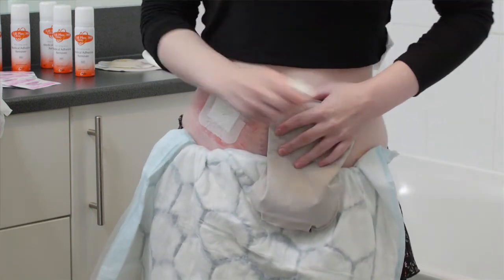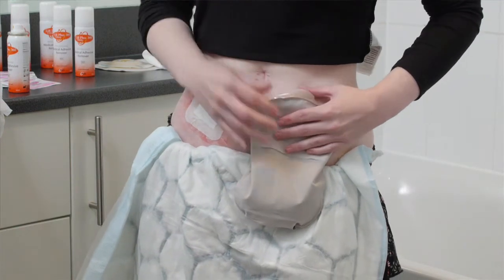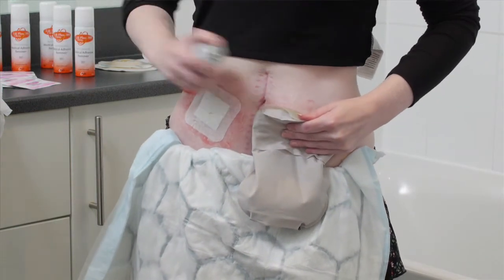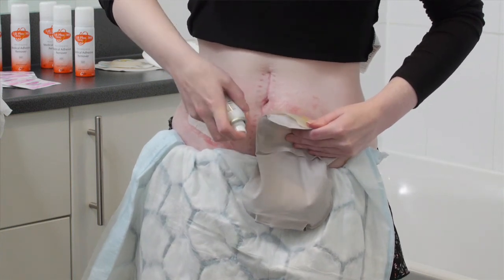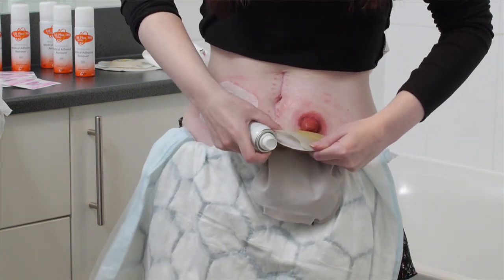The fact that you can spray the can at all angles and it gives an even flow is really good, so that you can just remove the bag with ease and it makes the whole bag-changing experience a lot easier.